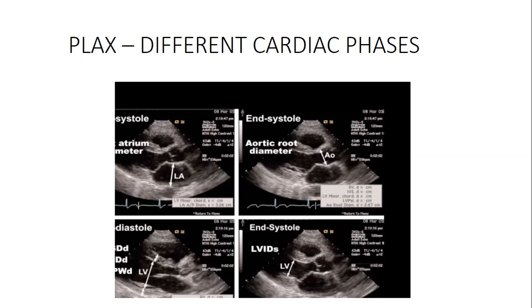Having known that PRF is the pulse repetition frequency, it is very important to marry it with the Nyquist limit and the pulsed wave Doppler. In simpler terms, the PRF helps pulsed wave to measure the velocities of blood at a normal range according to its range.